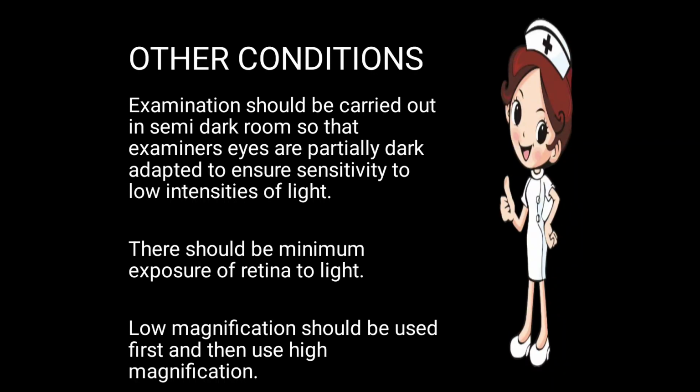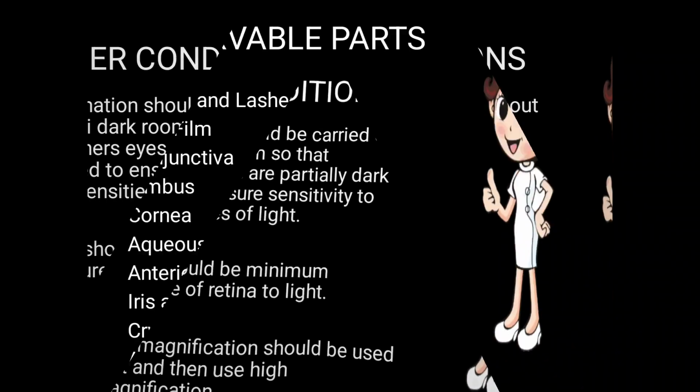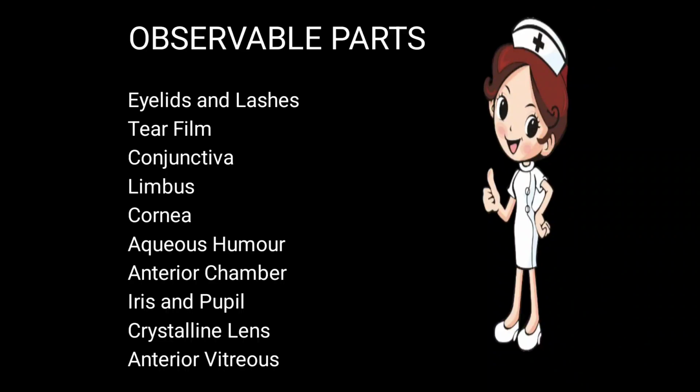Low magnification should be used first and then use the high magnification. Okay, we can use the low magnification first, or we can use the low intensity light first and then use the high intensity light, or the high magnification is done.